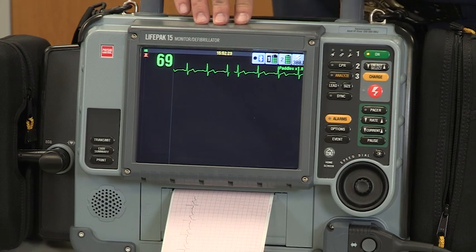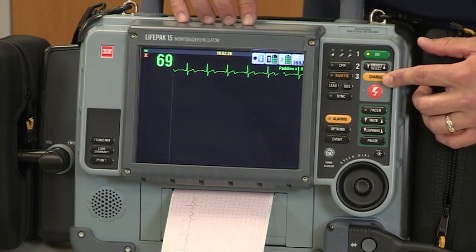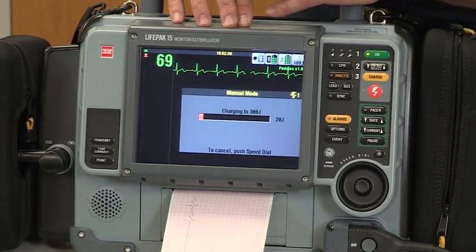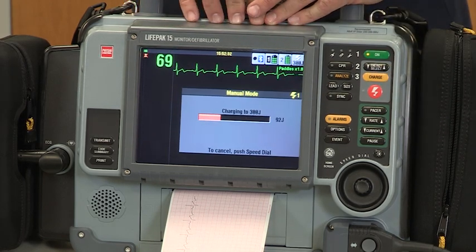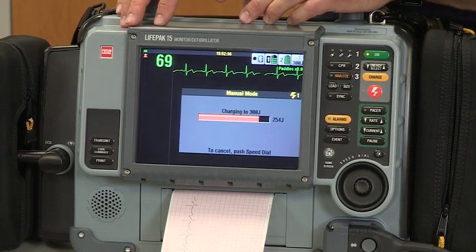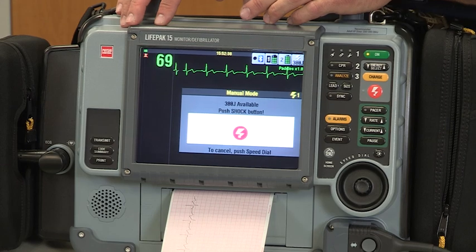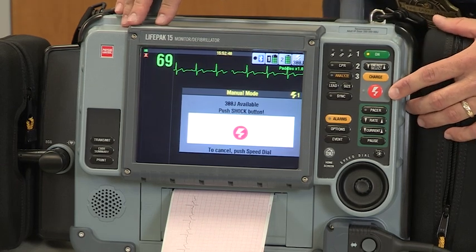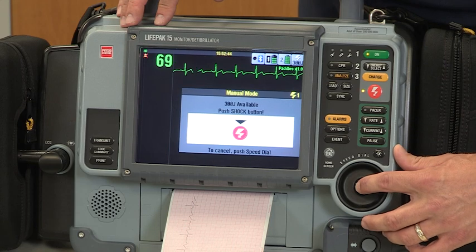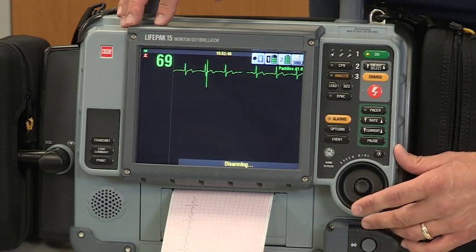Just like the feature with LIFEPAK 12, you come up on the end of your 2 minutes if you charge. And you're going to analyze a rhythm. And the rhythm is a non-shockable rhythm and you'd like to dump the charge, simply depress the speed dial selector and it will disarm the machine.